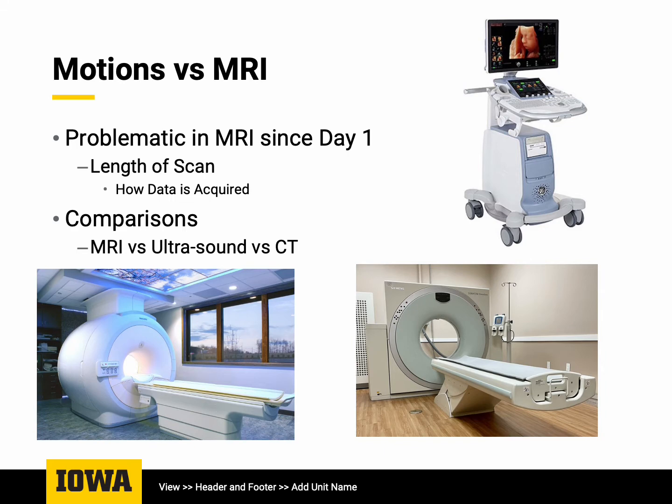This is a big problem, motion with MRI, because of the length of the scan, and the acquisition time with which it gathers the data is so long as compared to an ultrasound or a CT scan, which doesn't have that.